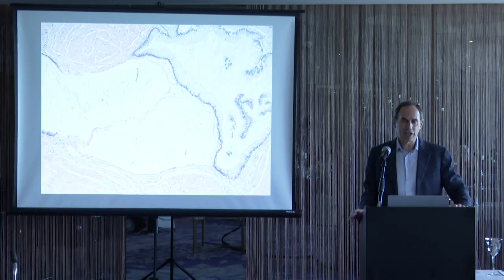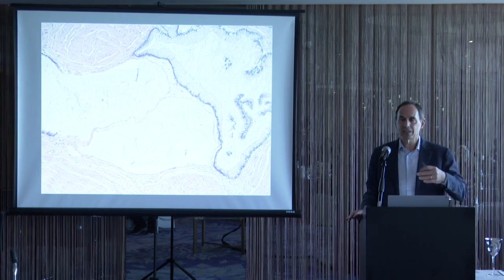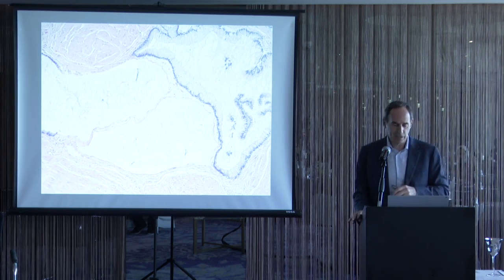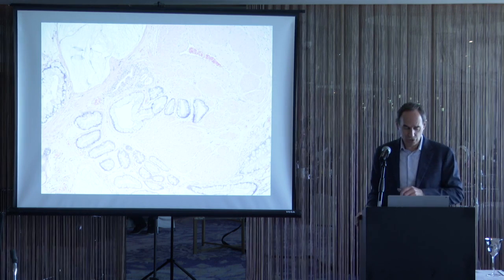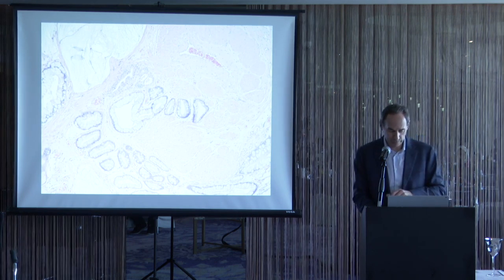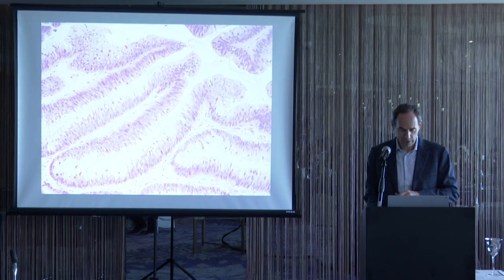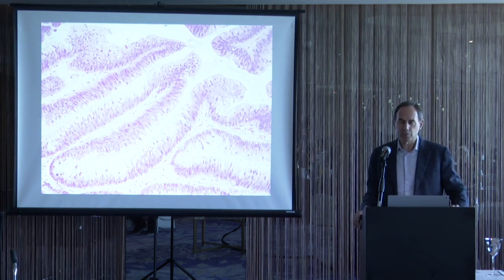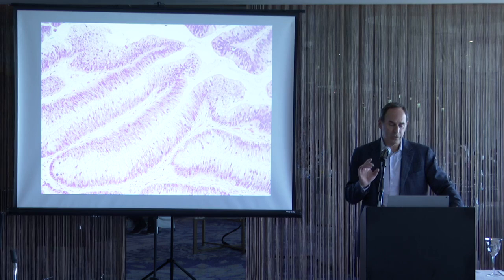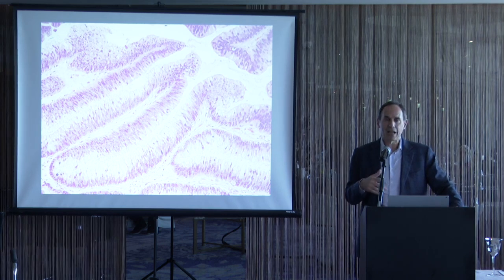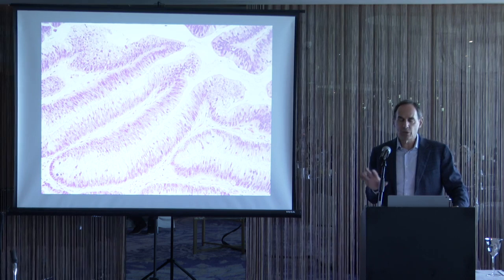Here we see intestinal metaplasia in the muscularis propria — thick muscle bundles top and bottom — but just because these glands are in the muscularis propria does not mean carcinoma. Extracellular mucin also doesn't mean cancer. Higher power shows totally bland cytology full of goblet cells. Occasionally intestinal metaplasia can get dysplastic, analogous to intestinal-type glandular lesions elsewhere.